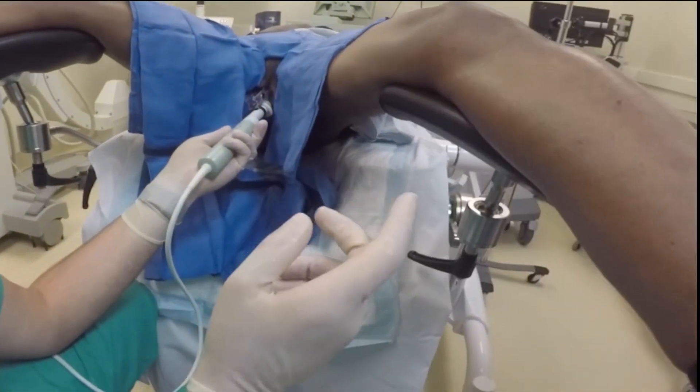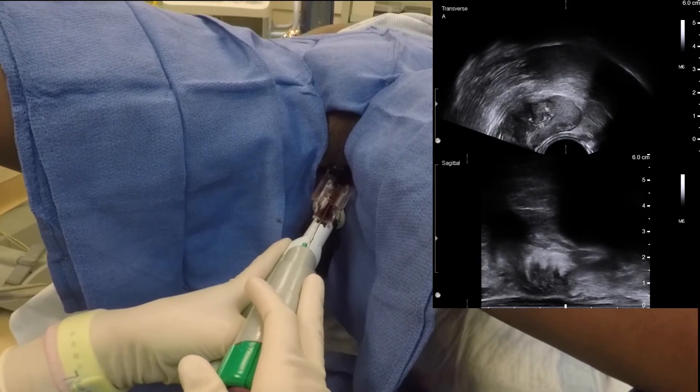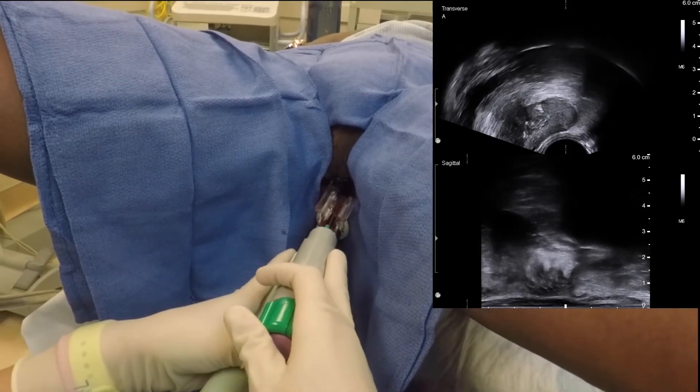When targeting the contralateral side of the prostate, the device needs to be removed from the right side and repositioned onto the previously marked left region.